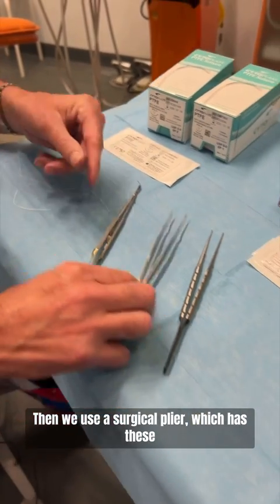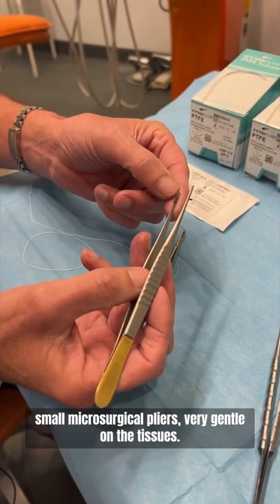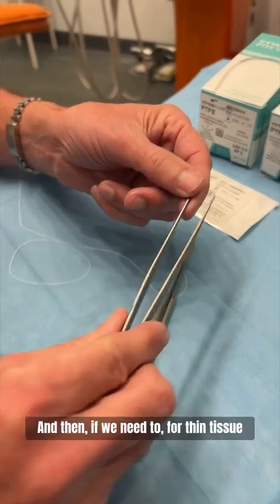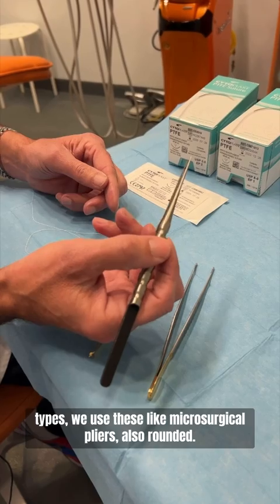Then we use a surgical plier which has these small microsurgical pliers, very gentle on the tissues. And then if we need to, for thin tissue types, we use these microsurgical pliers — also rounded.